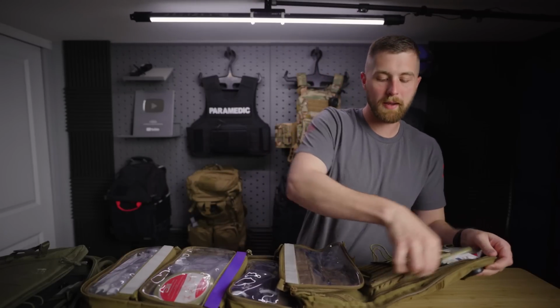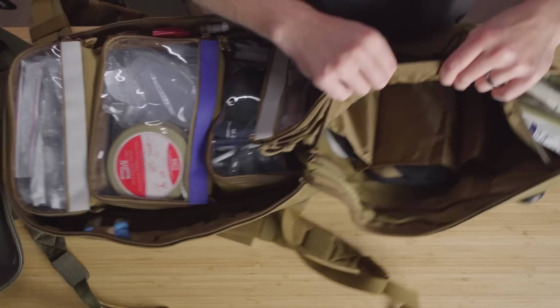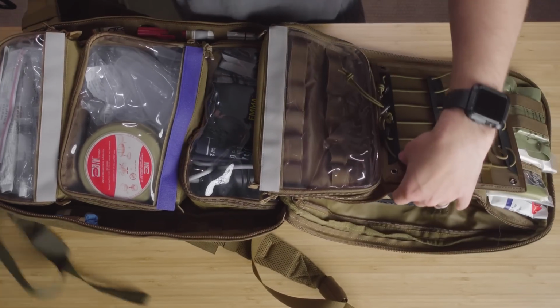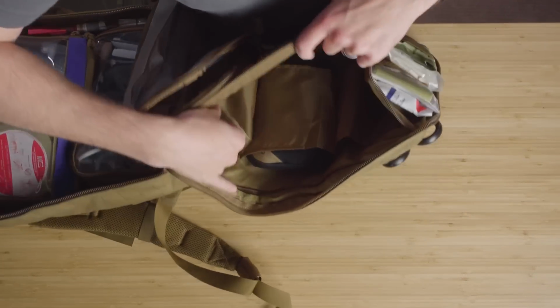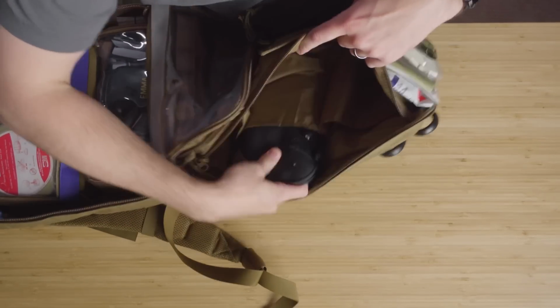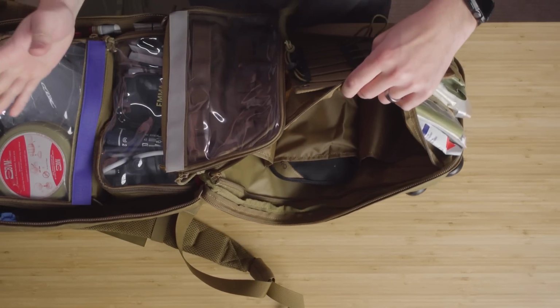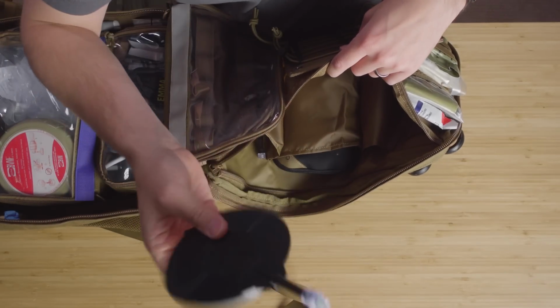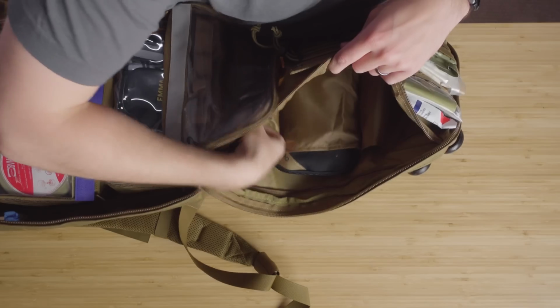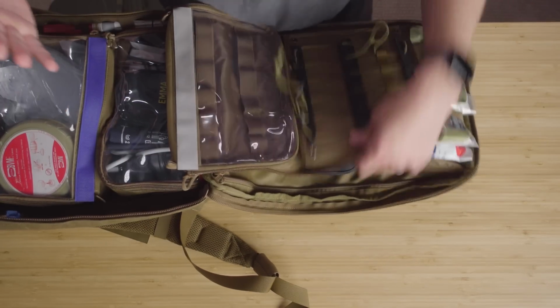Similar to the regular pack, you have these pockets back here, but things just fit a little bit better into this side. So you can see I've got my PrepMedic narc case. Fits perfect back here. I don't need access to meds super emergently, so for me, it works well to have it back here. And then I also have a Sam Medical junctional device back here as well. You could throw some splints in there, you name it.